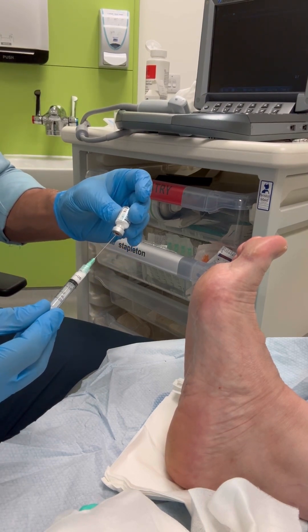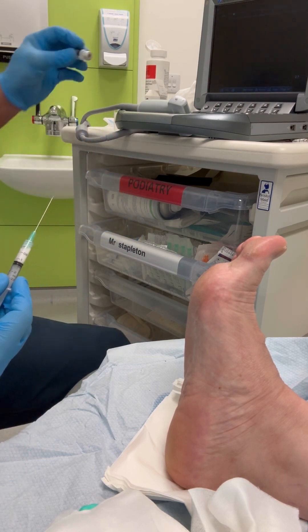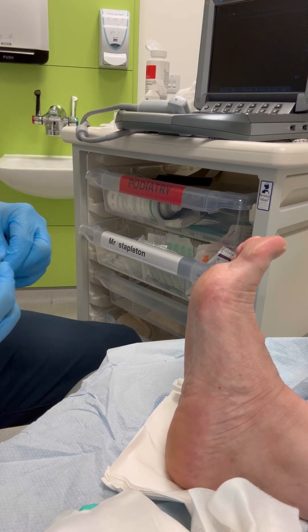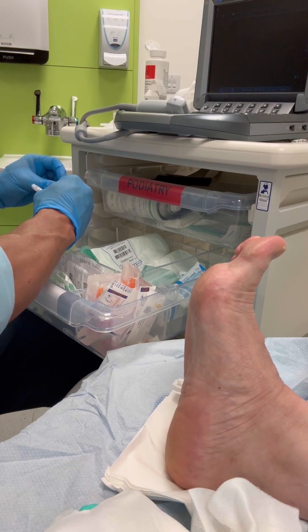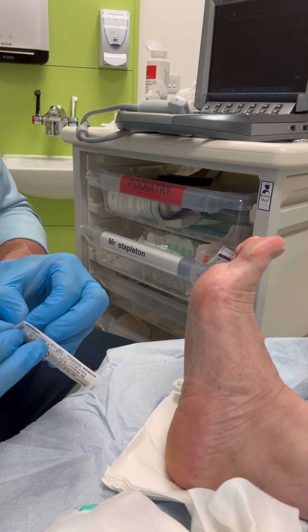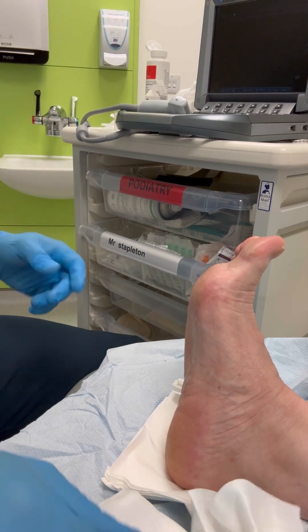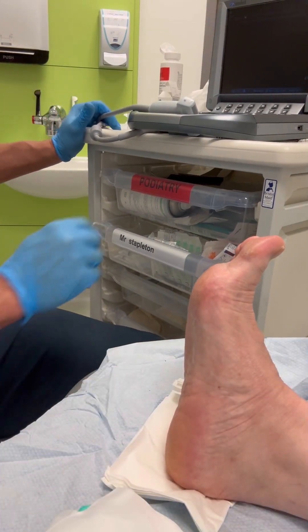The second injection uses a larger needle and it is a much deeper injection. My preference for this injection is to use Depomedrone, which gives a nice slow release and long-lasting result. I use a 27 gauge inch and a half needle, and this again is for patient comfort.